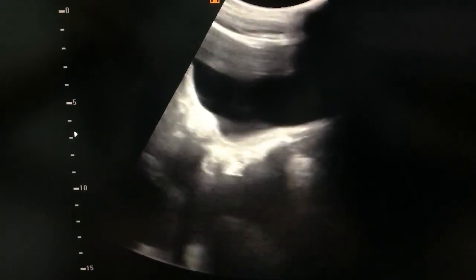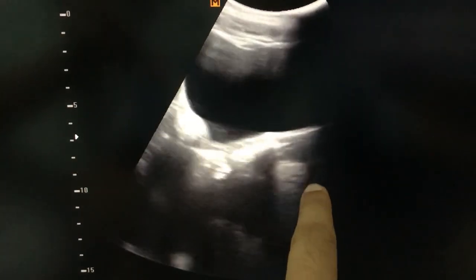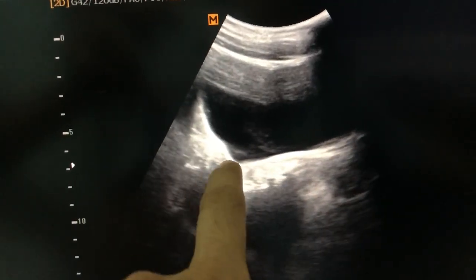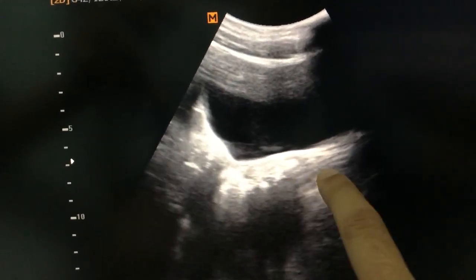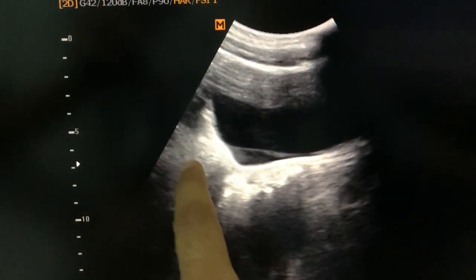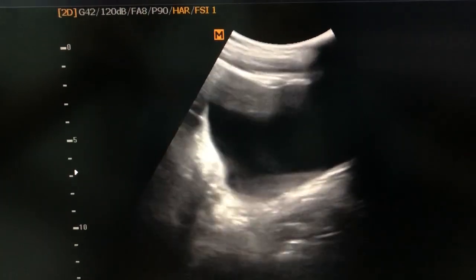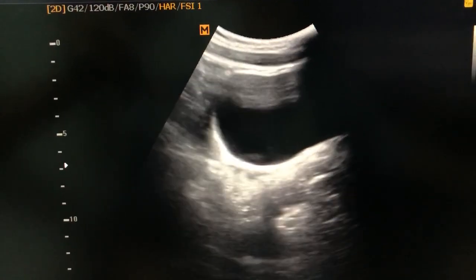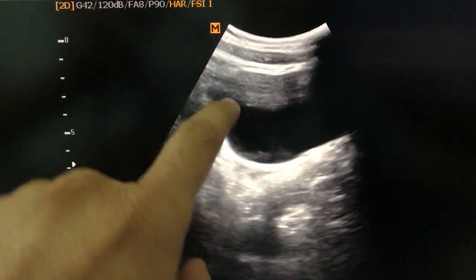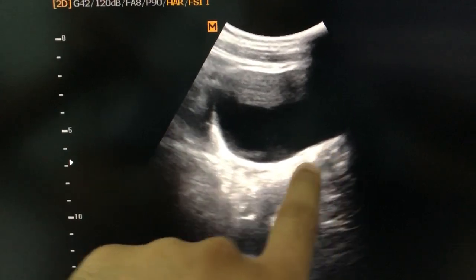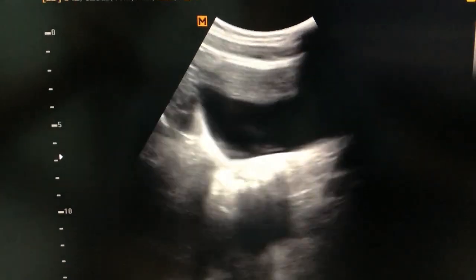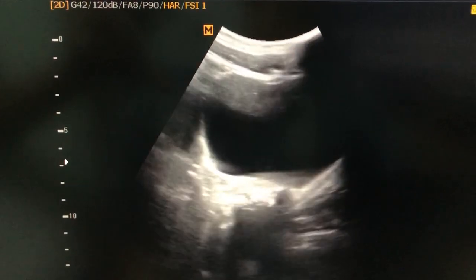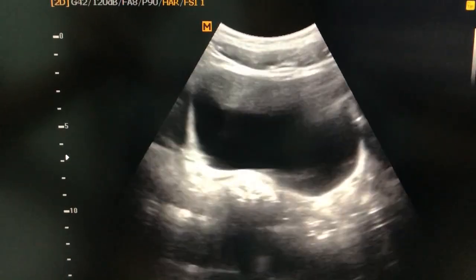This is the longitudinal section of the urinary bladder. Normally, we see the uterus starting from this angle to this angle, somewhere over this area. But here, in any direction — longitudinal or transverse section — we are not able to see the uterus. Normally the uterus is seen at this angle, from this point to the fundus of the bladder. So here there is no visualization of such a solid structure, which is the uterus. And this is Müllerian agenesis.